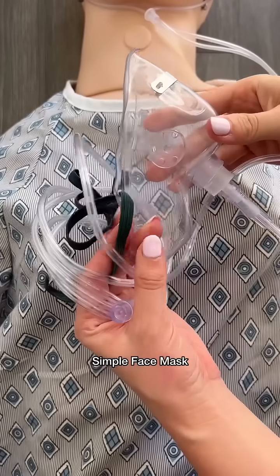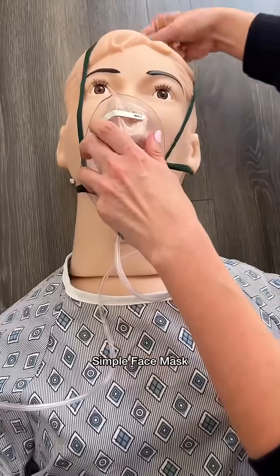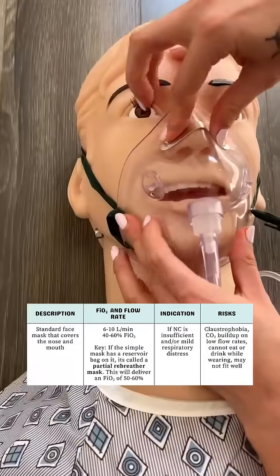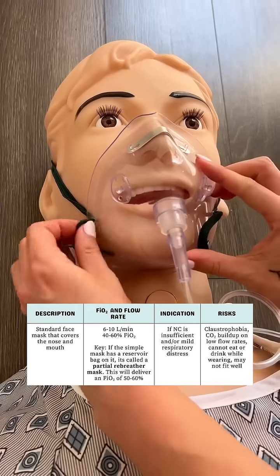Next, we have a simple face mask, aka the glorified nasal cannula. This is adults, and here is peds. We want to make sure we pinch the mask to fit the nose. This is good for mild conditions, but also even for mouth breathers.